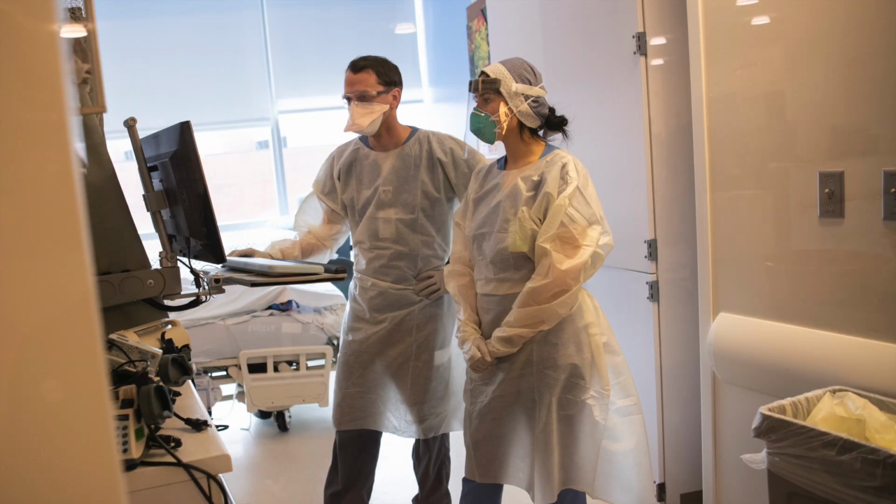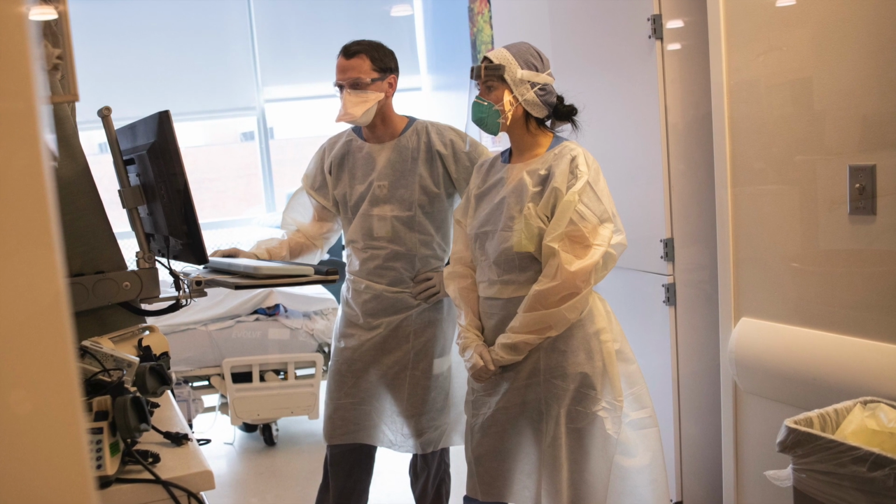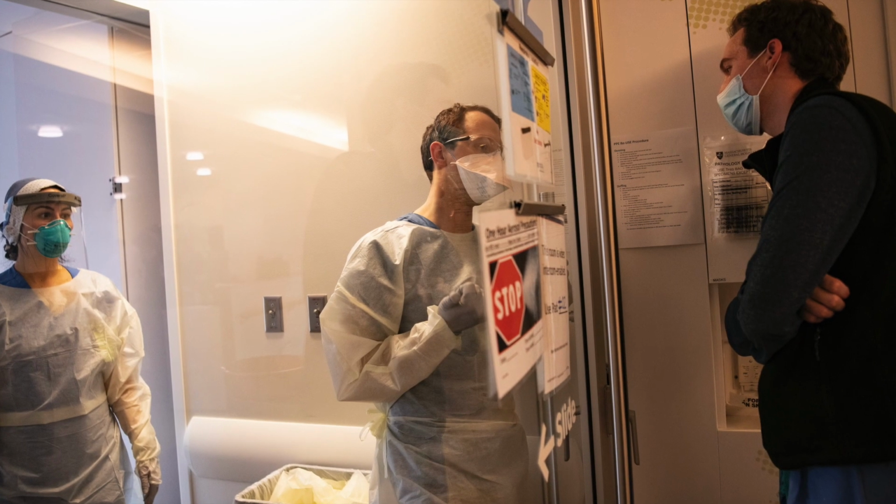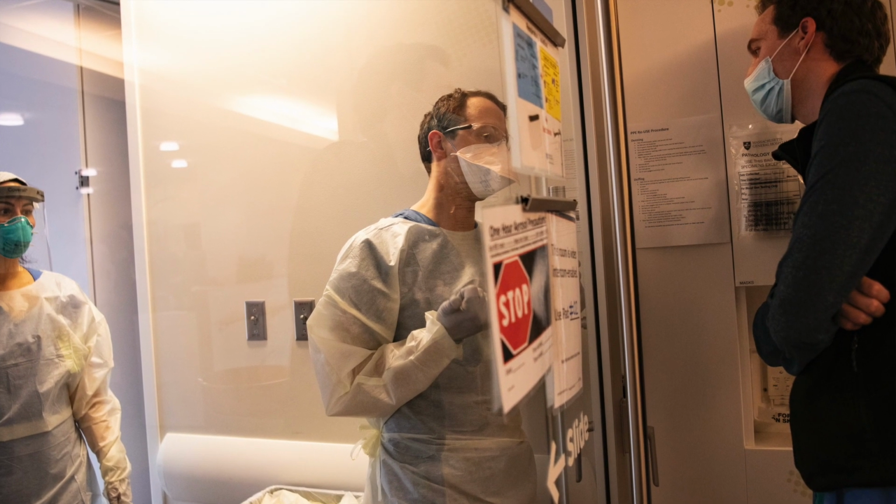You can vary the PEEP as you would with the best PEEP trial and look for the PEEP that corresponds to the lowest required transpulmonary pressure. Note that the use of esophageal balloons requires some specialized training, and not all centers will have access to the device. So how do intensivists choose? No one knows for certain since there are no head-to-head trials of PEEP titration.